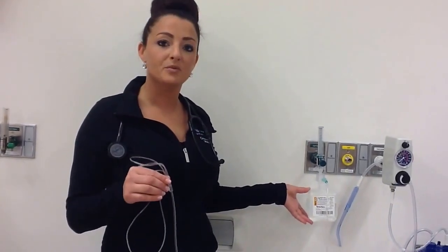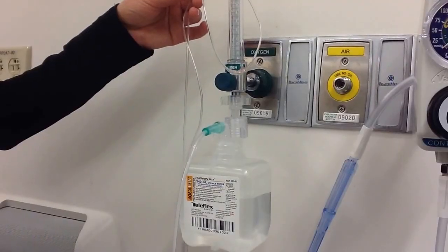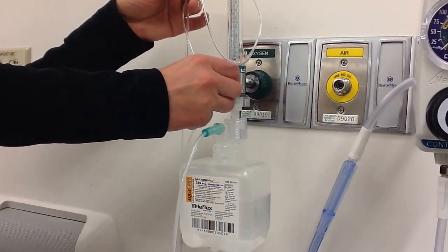Lastly, I'm going to talk about the nasal cannula. This oxygen delivery device delivers up to 40% FiO2 depending on patient inspiratory demand. This is the preferred device for transport. If the patient is not on transport and in the room, they must always be hooked up to a bubble humidifier. When the bubble humidifier is on, you should see bubbles.